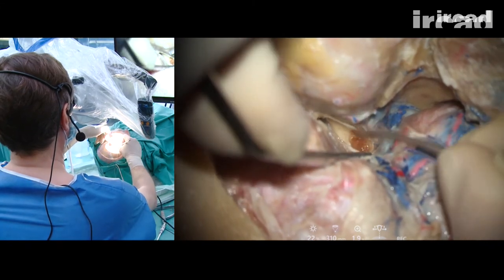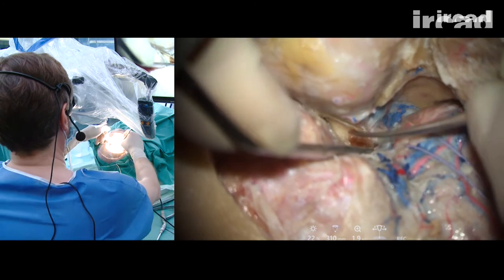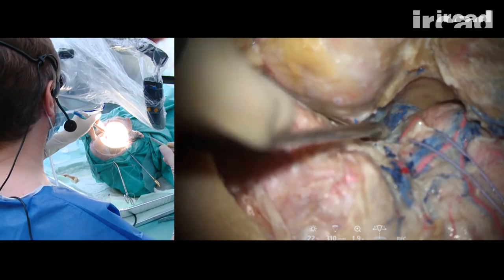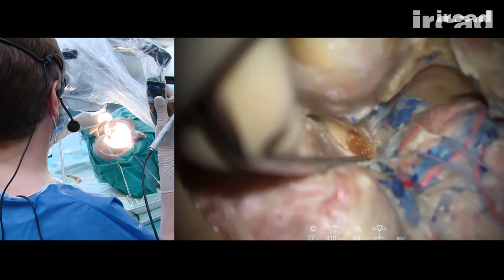Okay, you can see here the exit zone of the optic canal.